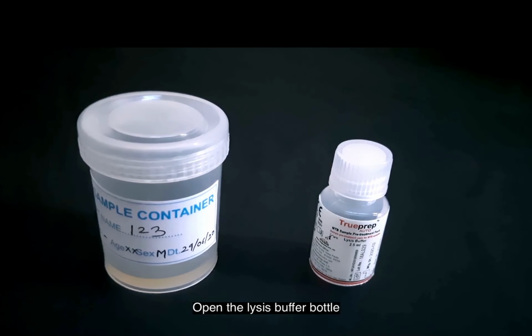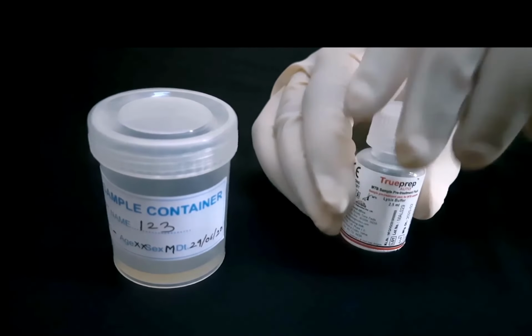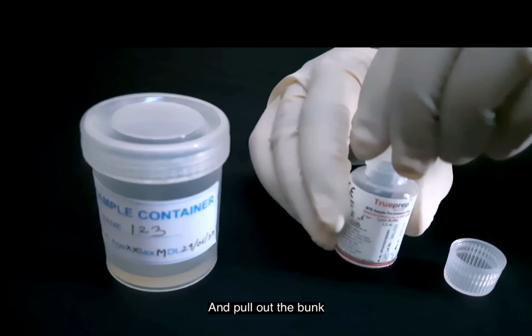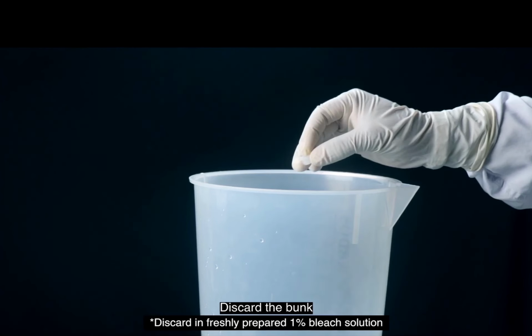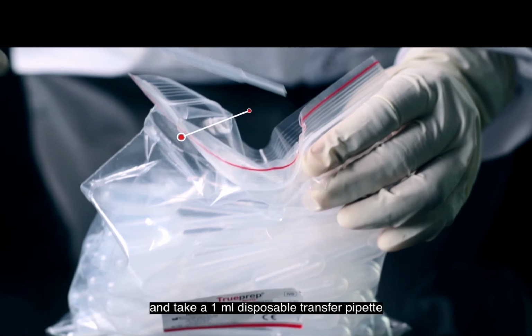Once your liquefaction is over, now our sample is ready. It is totally liquefied. Now you open the lysis buffer bottle. For each sample you have 1 bottle. It contains 2.5 ml of lysis buffer. On top there will be a rubber cork-like thing, which you discard. From the sample you have to take 0.5 ml.